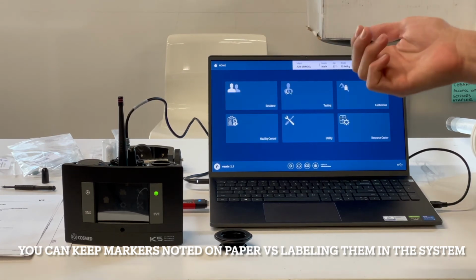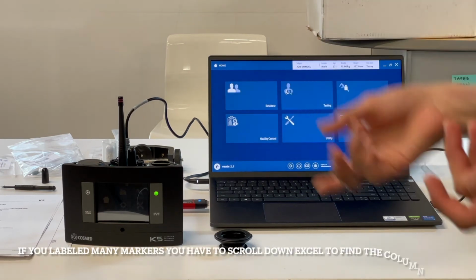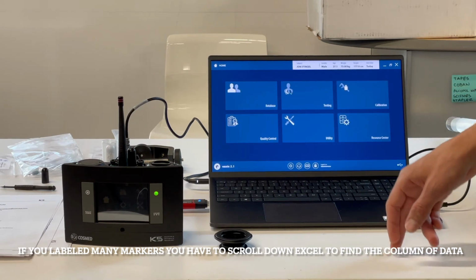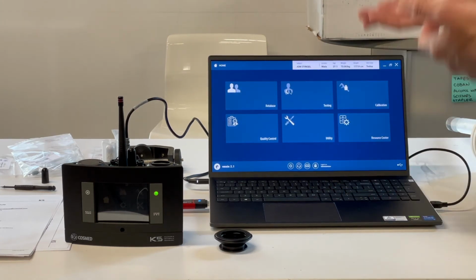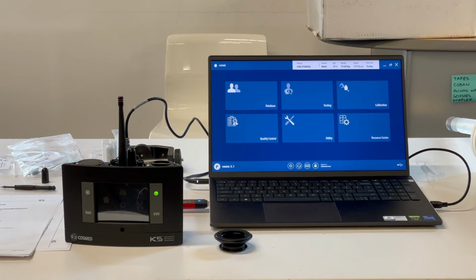And in Excel, you have to scroll all the way over to where all those markers are anyway. So I would typically just record the markers on the side, and make sure that I know where exercise started and ended. Personally, the only markers I've ever used are for arterial blood gas measures, so I've never used the feature to that full extent.